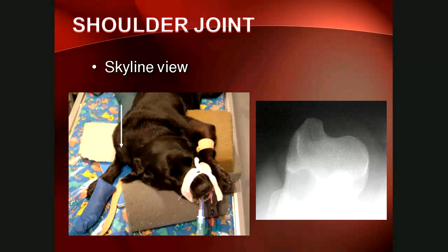An additional view for the shoulder joint is the skyline view — essentially looking down on the cranial part of the shoulder. Its correct name is the cranial proximal to cranial distal oblique view, and it demonstrates the biceps groove. On this radiograph, the concavity is the biceps groove, the structure jutting out is the major tubercle of the humerus, and the minor tubercle is on the other side. The dog lies in sternal recumbency with the cassette placed under a flexed shoulder and on top of the antebrachium. This view can give a lot of information about pathology of the biceps groove area.